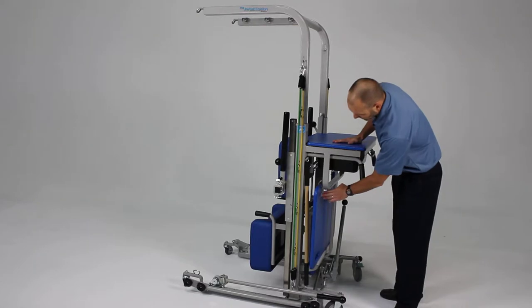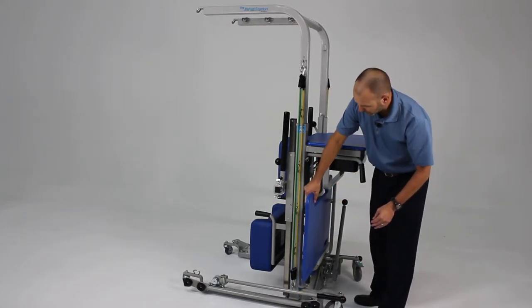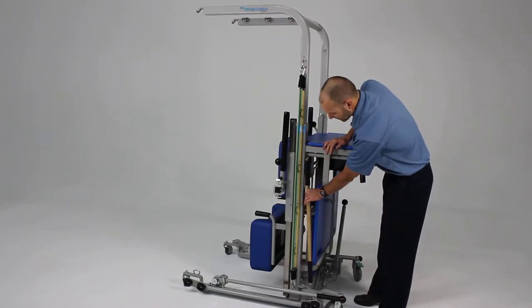We also have back here a storage area that includes a table, which we'll show you in a few moments, and a bar that's used for some of the resistance exercises.